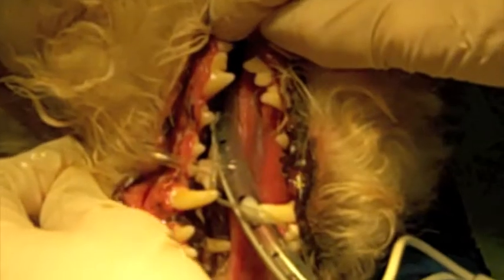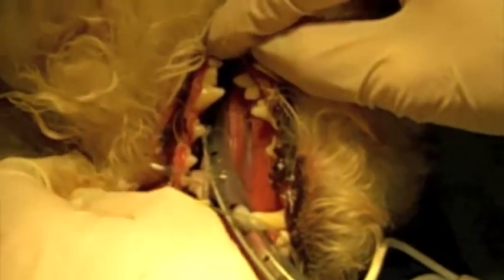You can tell in the video we have a much happier mouth now. The gums are already less red and all the tartar is gone. And that's the end of our dental cleaning.